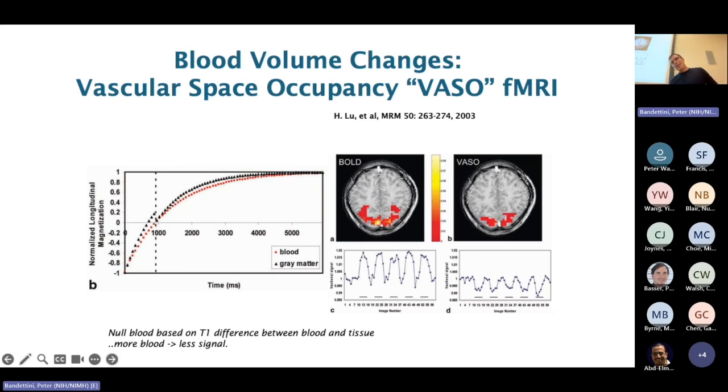And once you give that, all the signal is slowly, the longitudinal magnetization is slowly recovering. So tissue is characterized by its T1, which is the longitudinal magnetization, and its T2 or T2 star, which is its transverse magnetization.